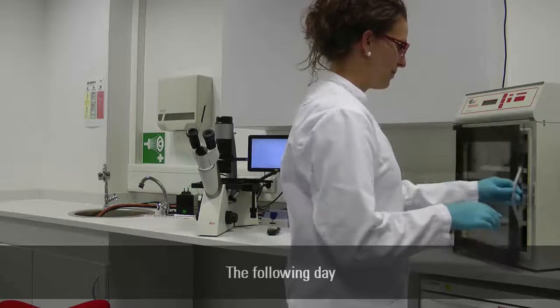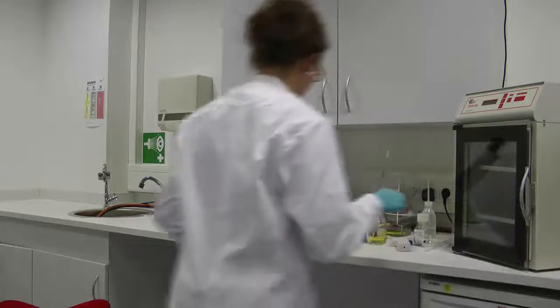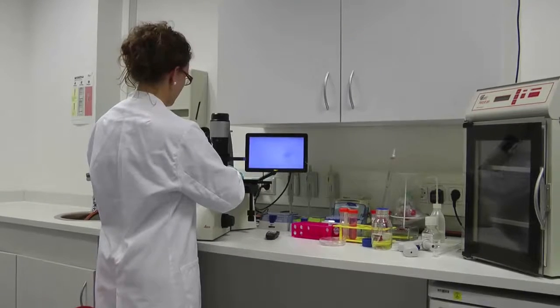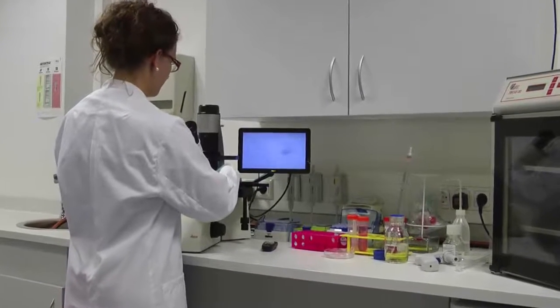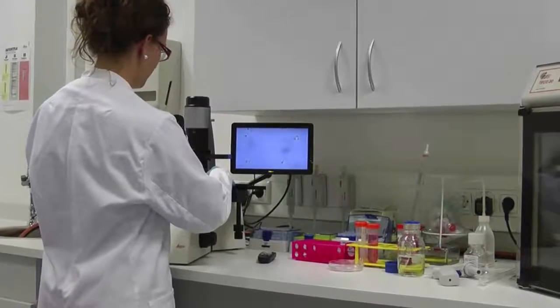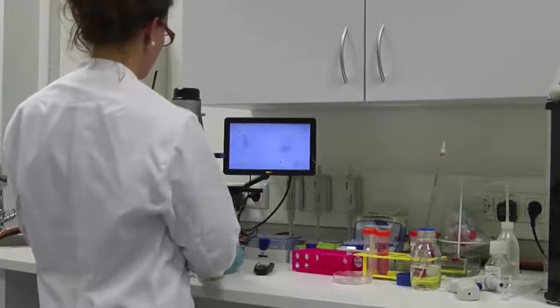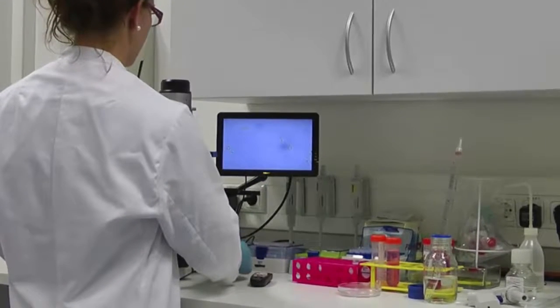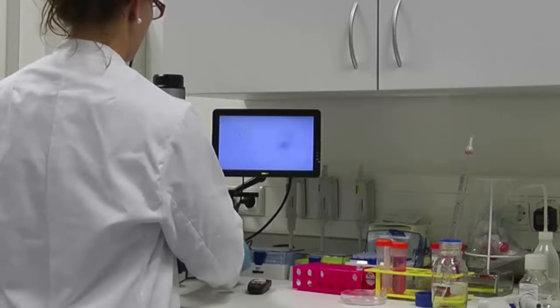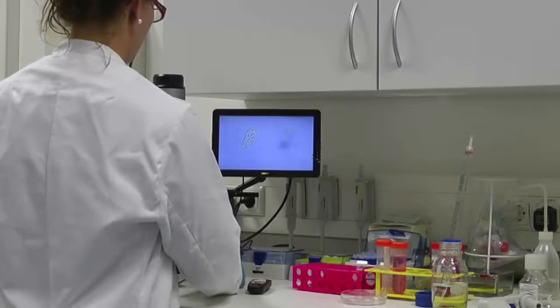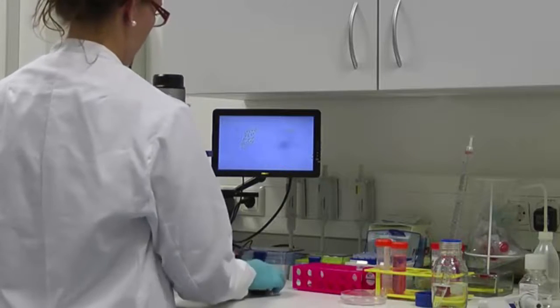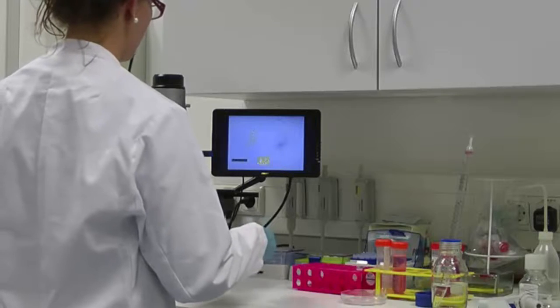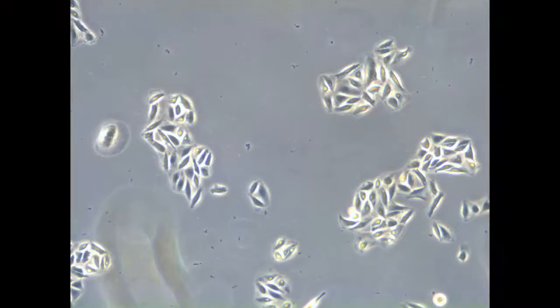Check cells 24 hours later under the microscope for shape, adhesion and contamination. Cells should be attached to the bottom of the dish and starting to grow and divide. Grow cells until they are confluent and ready for your experiment or next subculture.